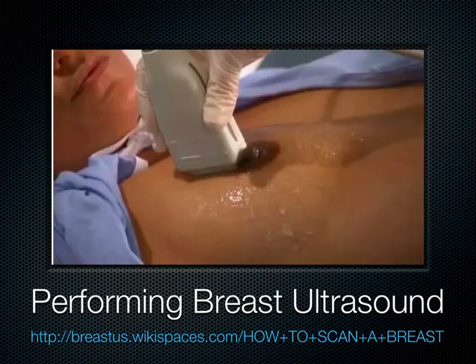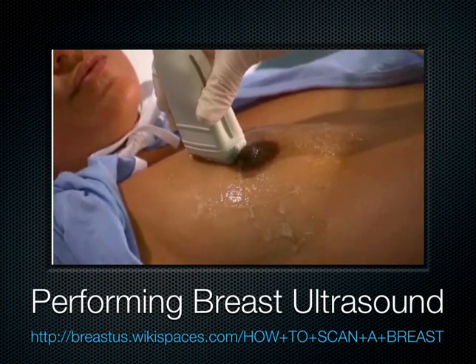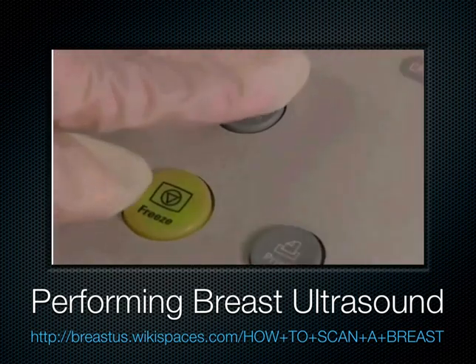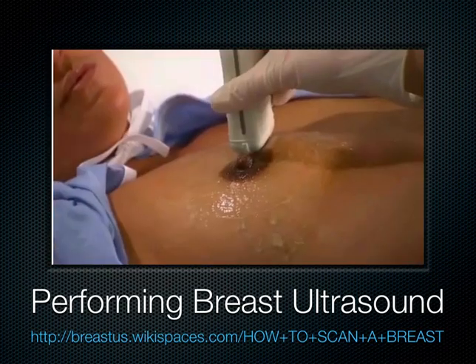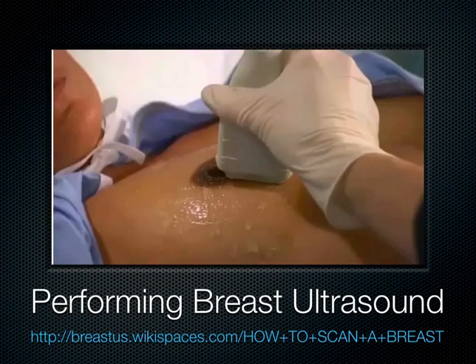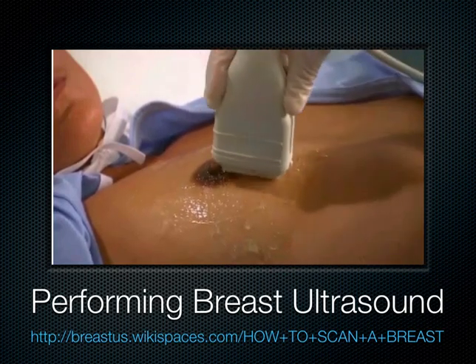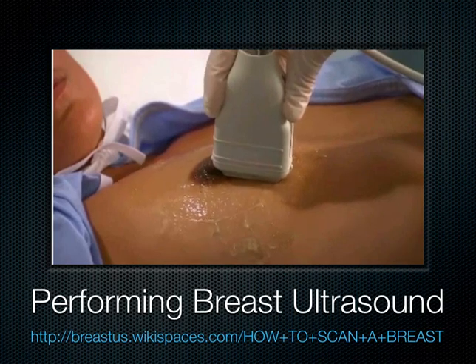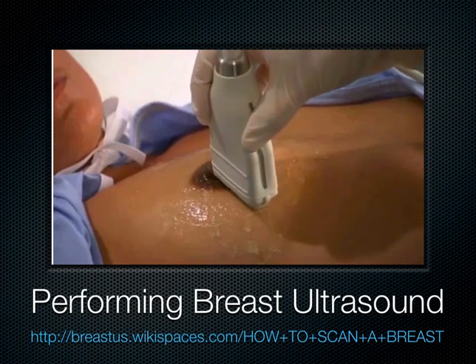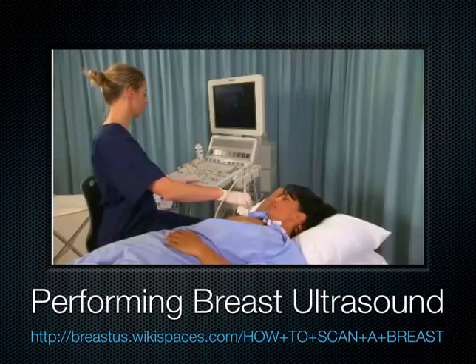Unfreeze the image and then scan the breast by rotating through every clock position in a clockwise direction towards 6 o'clock. Freeze, annotate, and save the images at 1, 3, and 4 o'clock. After obtaining an image at the 6 o'clock position, reorientate the transducer so that the notch faces away from the nipple. Continue to scan in a clockwise direction, saving annotated images at the 7, 9, and 10 o'clock positions.